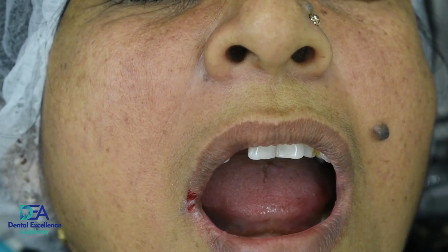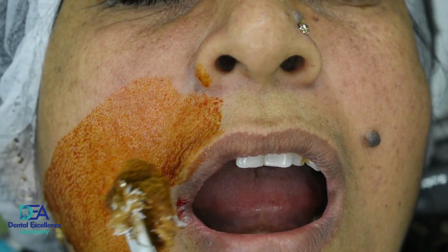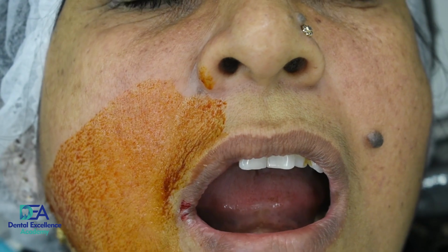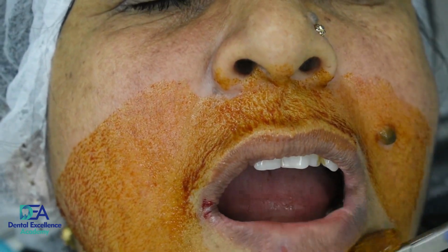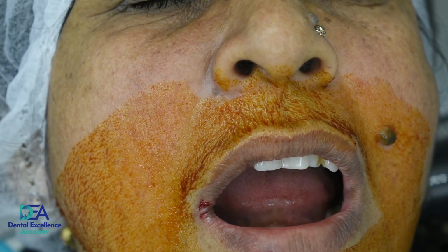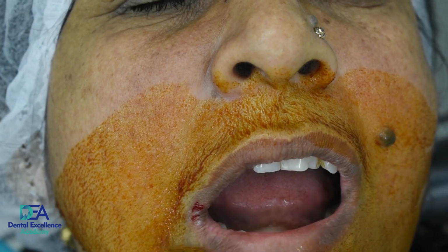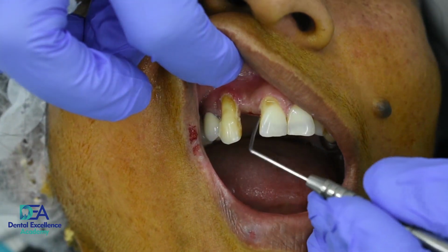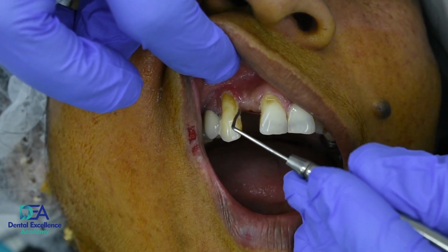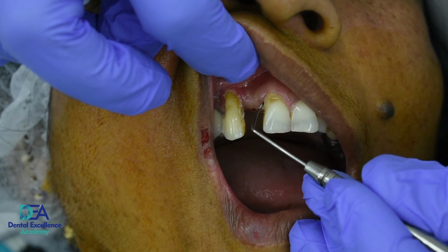So now I'm starting with the preparation of the site. With the betadine, we are giving a scrub to the patient so that there is no cross infection. We have injected the patient already. Now I'm checking for the anesthesia. So the anesthesia is working properly.